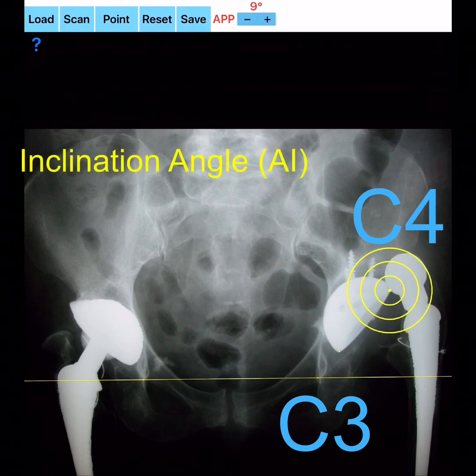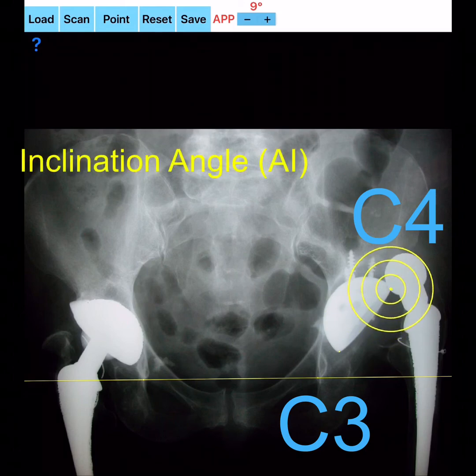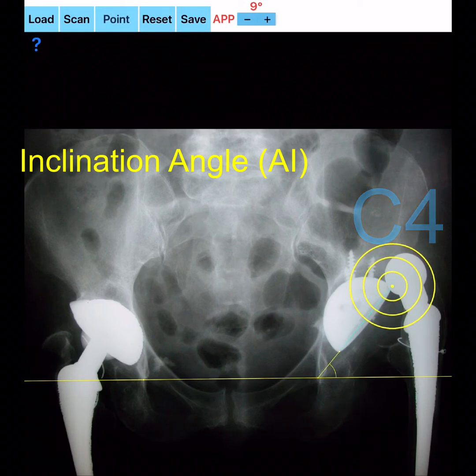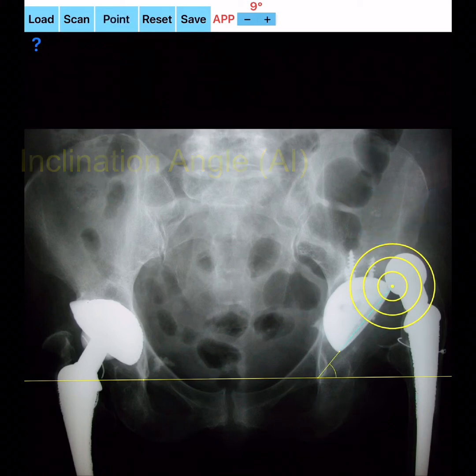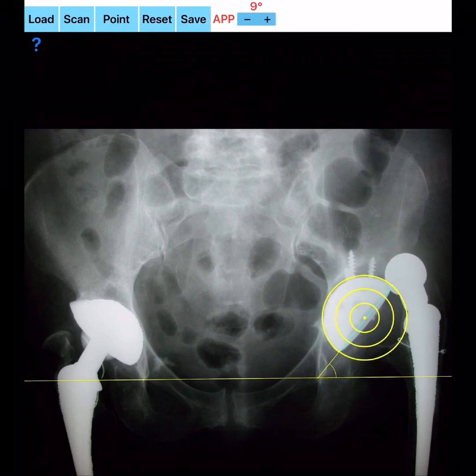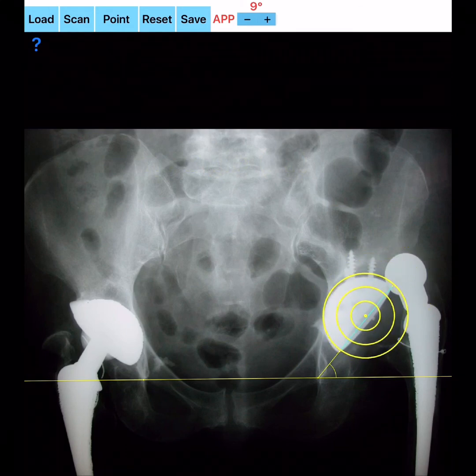The long axis of the imaginary ellipse — the angle subtended between line C3–C4 (long axis) and line T1–T2 (inter-teardrop line) — forms the radiographic inclination angle of the cup, RI, which is calculated and printed on the screen.